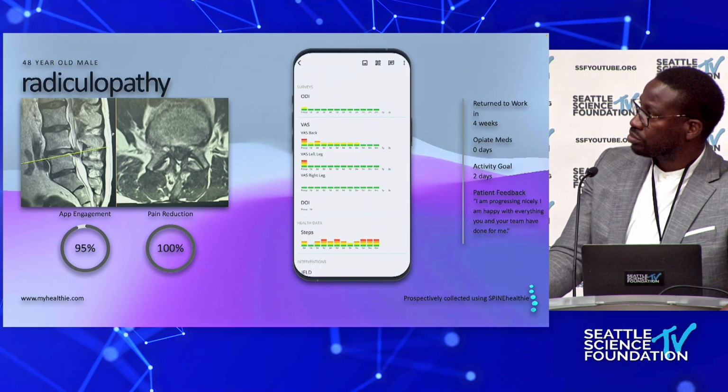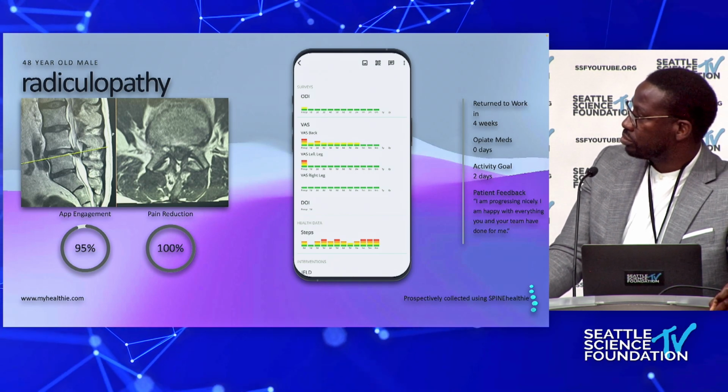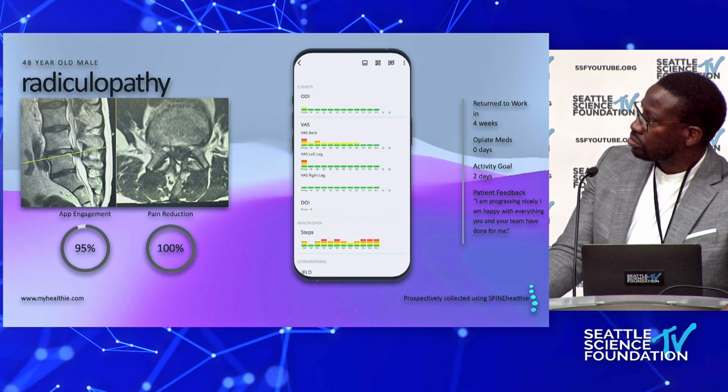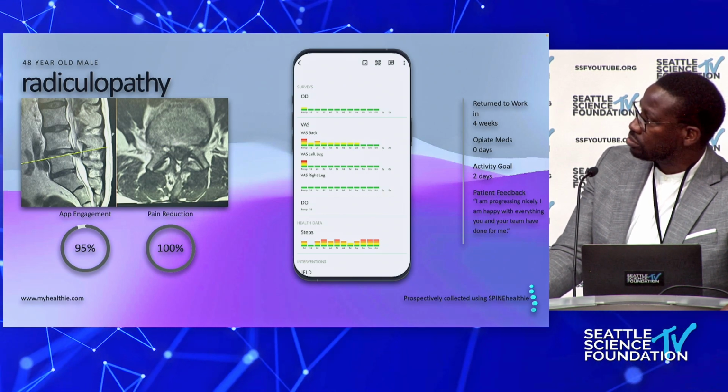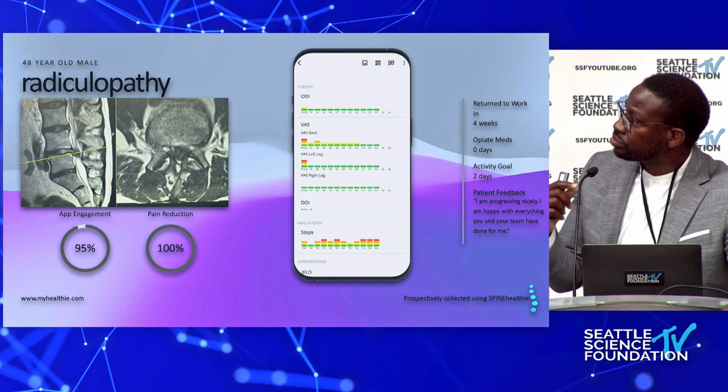Sometimes if you ream in that situation, you can actually just get a big dural tear right there. So I think for the people who are new and trying to pick this up, you can't always utilize both approaches. I think you have to be careful when that traversing nerve root is pinched out a little bit, almost into the beginning of the frame and from medial lateral. But I would do interlaminar on this one too.